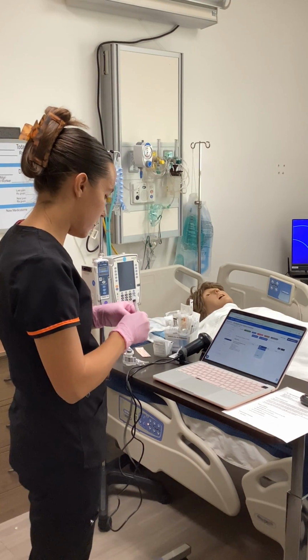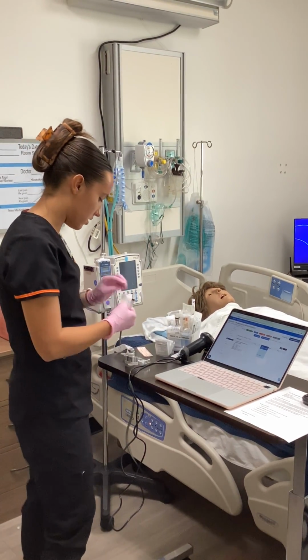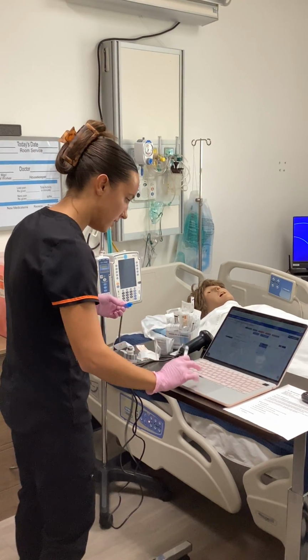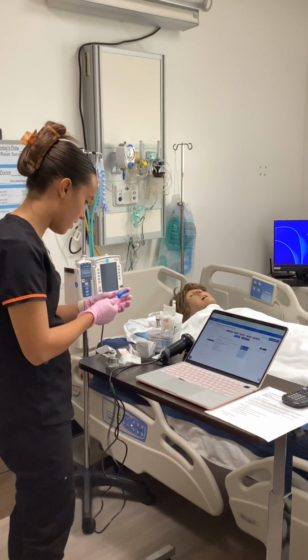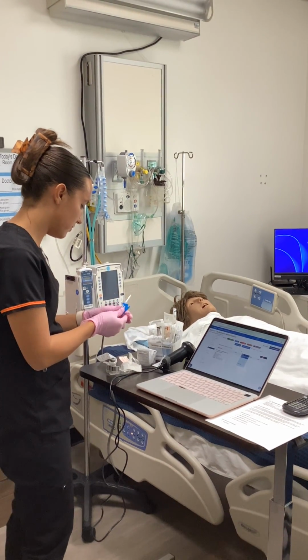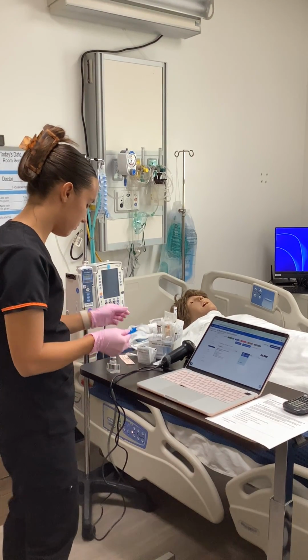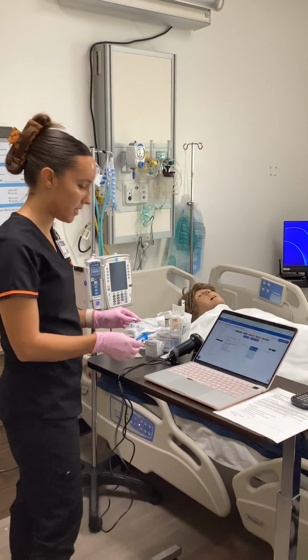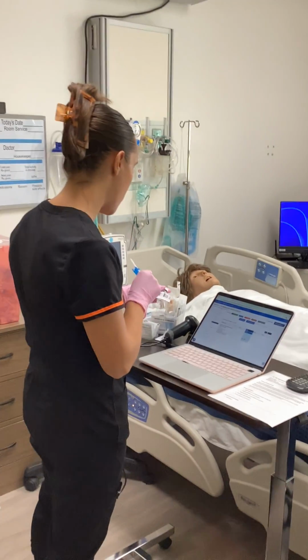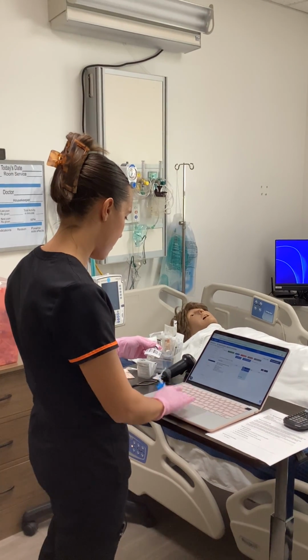So before giving this as well, I'm just going to set this up really quick. Okay, I'm just going to do one last check just to make sure before I draw this up that this is ketorolac for Mrs. Smith, for Jane Smith.